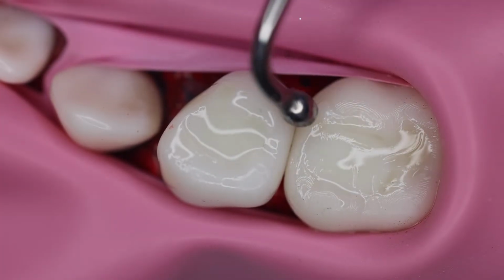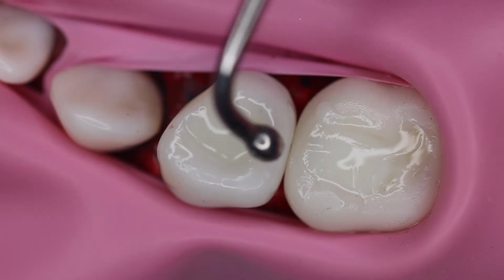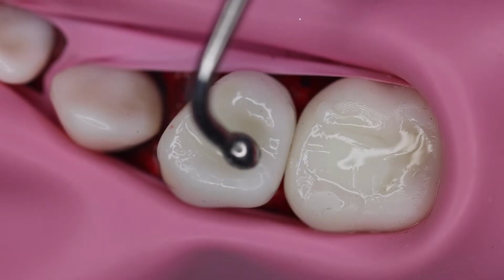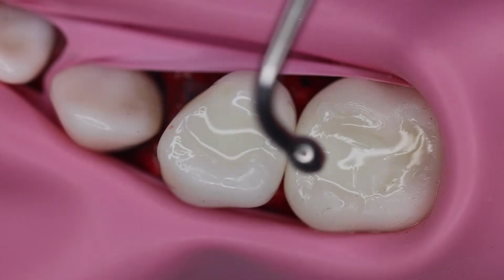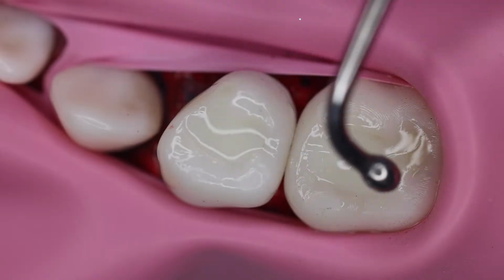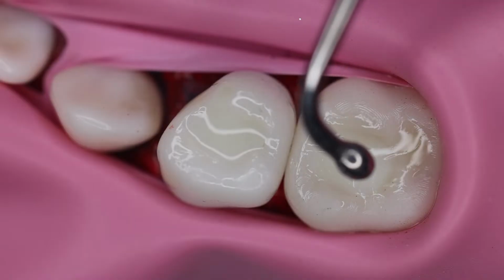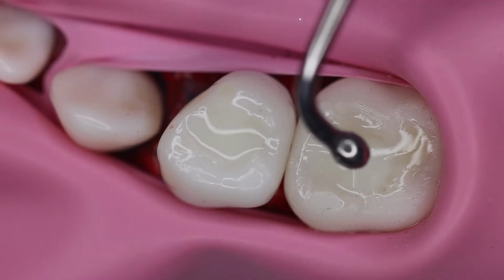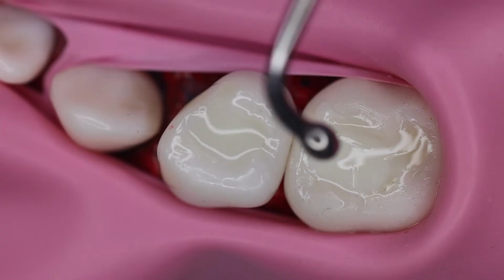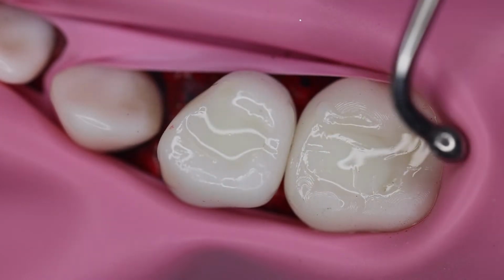It is smoothly occupying all the area, and in the adjacent teeth we can hardly differentiate between the tooth and the restorative. This is the advantage. This restorative, the Activa Kids Bioactive, will be working inside the tooth and would not allow demineralization or bacterial infiltration, and it would enhance remineralization. This is the basic advantage of this restorative.